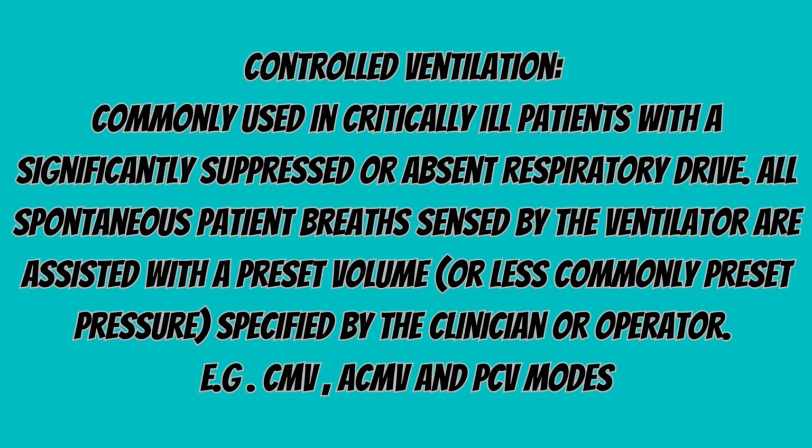Controlled ventilation, commonly used in critically ill patients with a significantly suppressed or absent respiratory drive. All spontaneous patient breaths sensed by the ventilator are assisted with a preset volume, or less commonly preset pressure, specified by the clinician or operator. Example, CMV, ACMV and PCV modes.